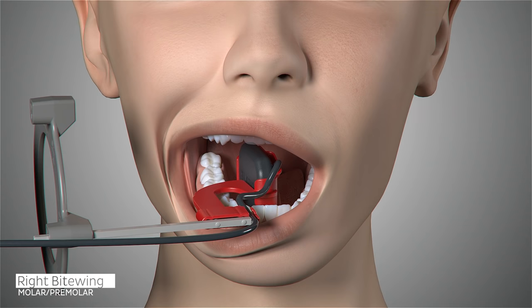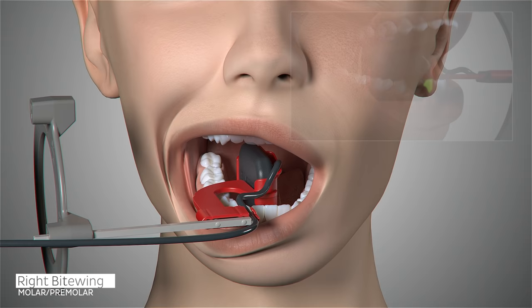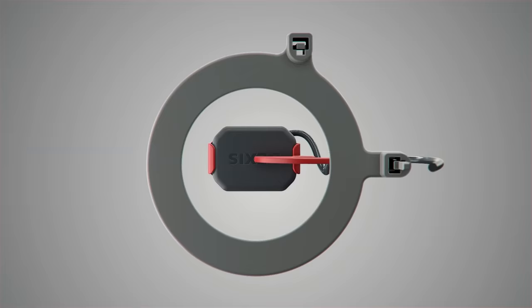Ask the patient to open slightly, slide the sensor forward, and center the first and second premolars on the sensor. Move the sensor toward the midline and slightly forward again in order to capture the distal of the canine. Ask the patient to close. Slide the aiming ring close to the patient's face, position the x-ray emitter cone flush with the aiming ring and trigger your exposure.